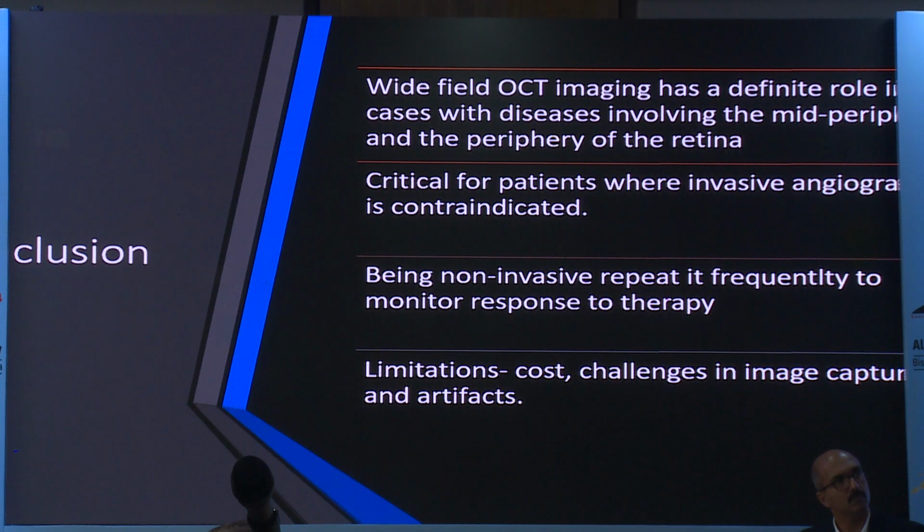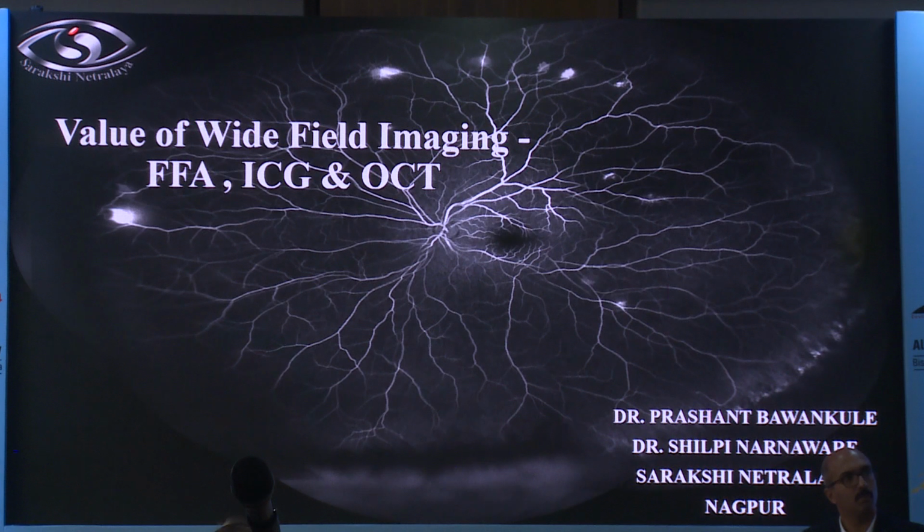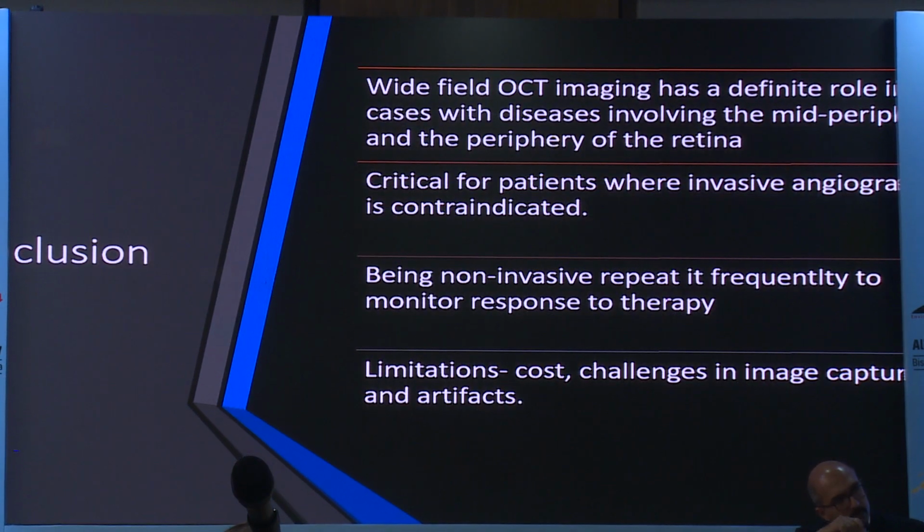And certain other things I feel ICG is very useful is if you want to do, of course we don't have the dye now, but for pre-PDT I don't think we can depend only on OCT for that. So these are the conditions. But sir, you're right. I think as technology evolves, we will be moving forward. I'm also working with some company in Greece and Germany to get the Visudyne to India.